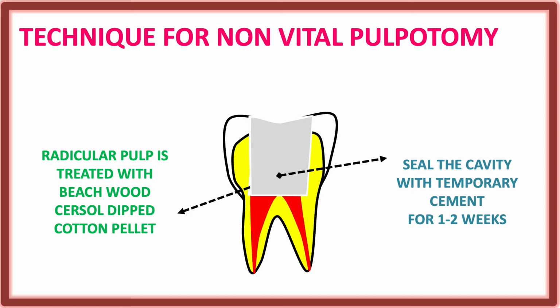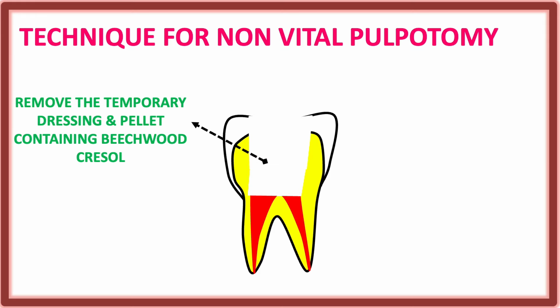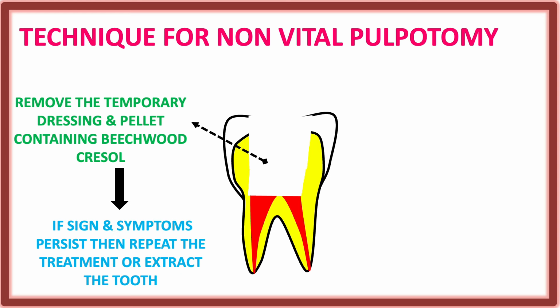Now, second appointment. After 1 to 2 weeks, we'll call for the second appointment. What we will do in the second appointment, we are going to remove the cotton pellet dipped in beechwood cresol. If signs and symptoms persist, then we'll repeat the treatment, otherwise extract the tooth.